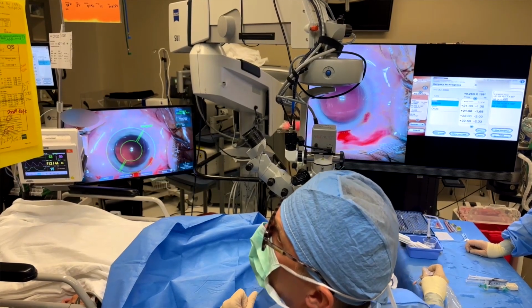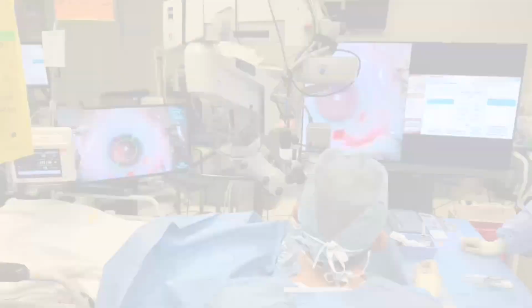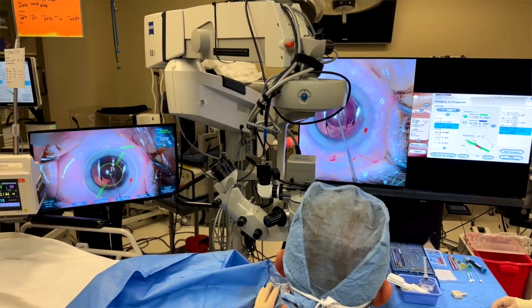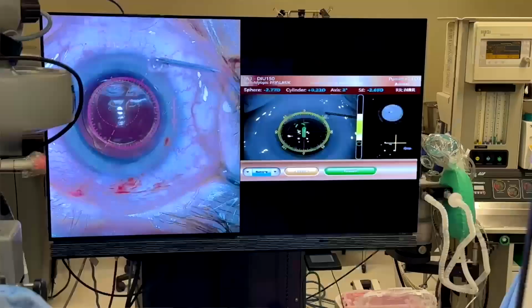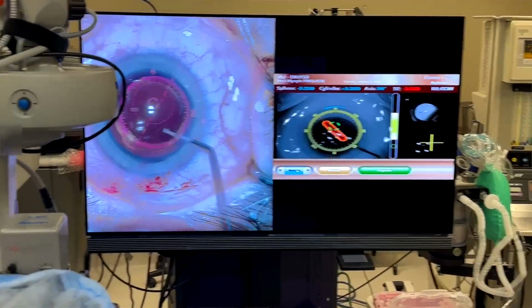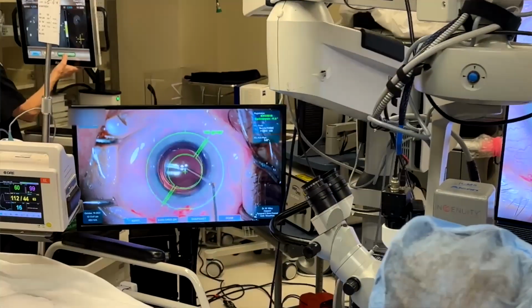I think that there could be two different ways of looking at it. You could have a belt and suspenders and have redundancy using preoperative and intraoperative, or surgeons may find that they can sort of become more efficient by just using preoperative diagnostics to guide that surgical treatment and potentially eliminating a time-consuming step for that particular case. I think for those surgeons, it will translate to a high return on investment by saving time and energy during an expensive portion of that surgeon's day. The most expensive time is that operating room space, and if you can help save time in the operating room, I think that does have a direct return on investment.